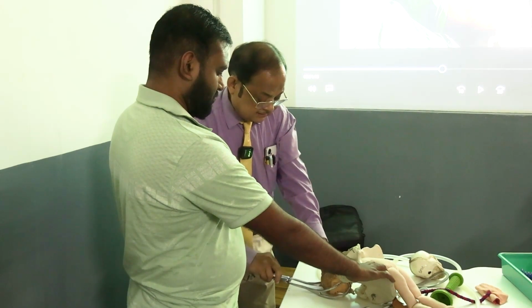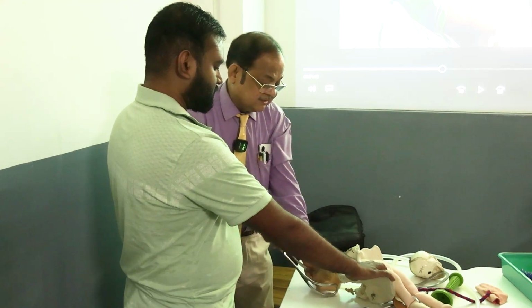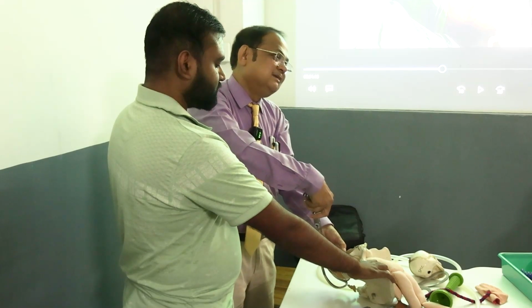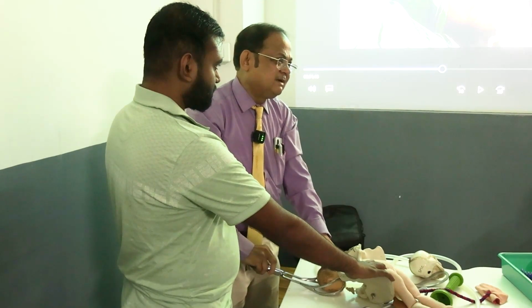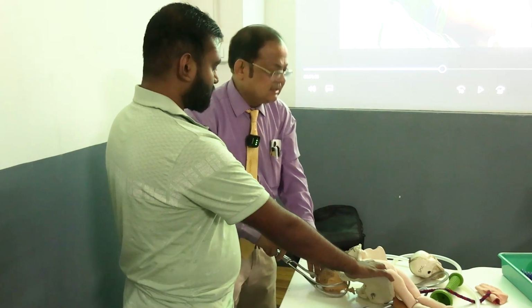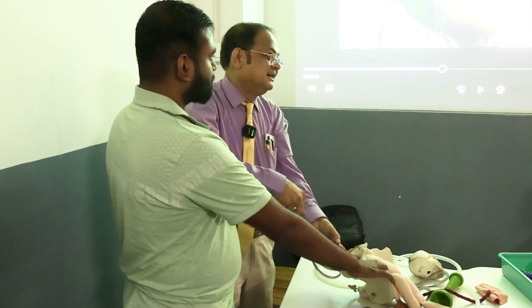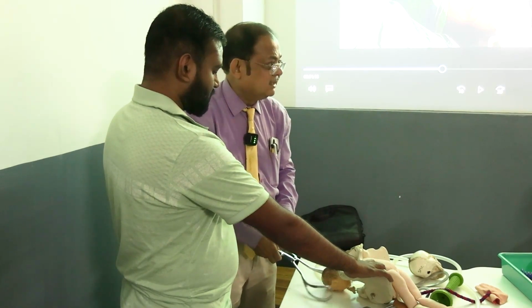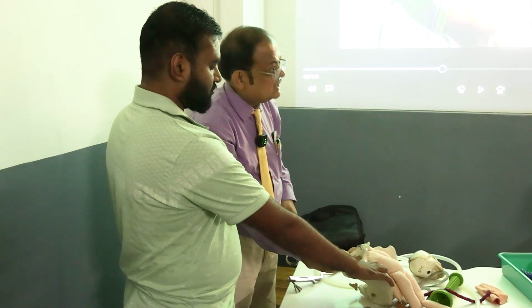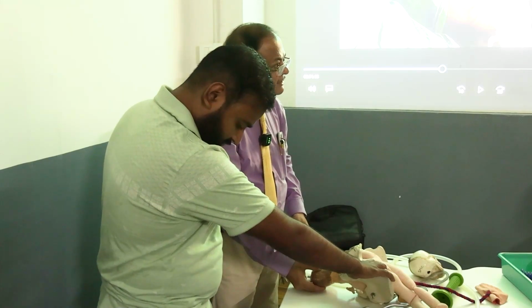And then horizontally downward, and then the head is delivered by forwards and upwards. So three movements: one is downwards and backward, one is horizontally downward, and last is forwards and upward. The head is delivered by extension. Then you open the screw and release, and what will happen? Left occiput anterior, restitution and external rotation, anterior shoulder delivered, posterior shoulder delivered.